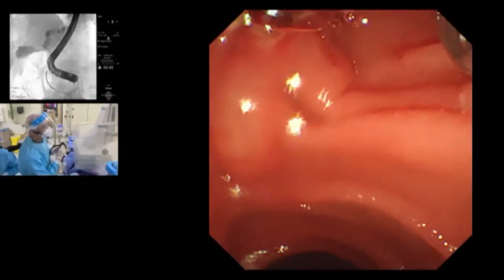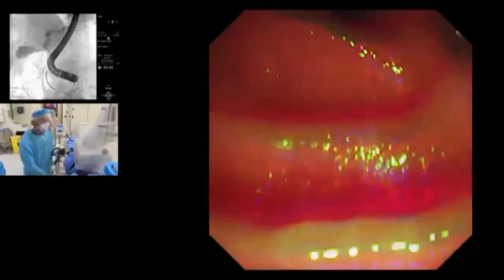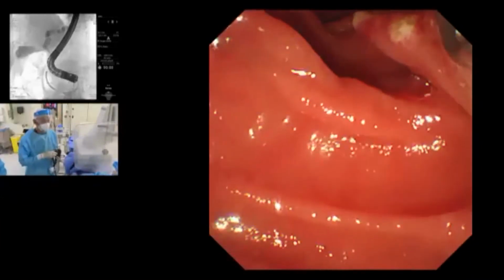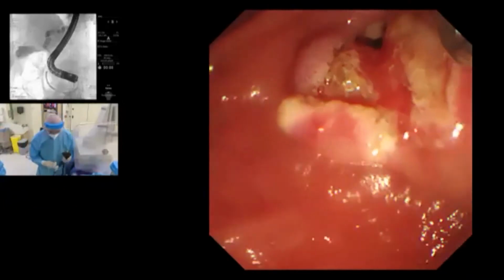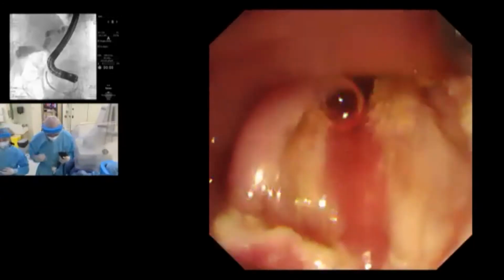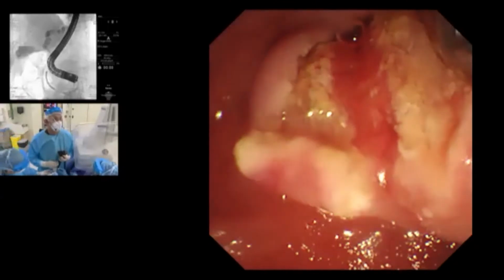Oops. So this patient seems to be easily dropped. It's a bit of an unstable position. Khalid, I totally agree with you. It becomes a burden with a case that is difficult like this. But the advantage of a spyglass is that it's a one-man operation rather than having two people in the room, which becomes crowded sometimes. Let's try to cannulate with the spyglass. Thank you. All right, now I have a good position. I'm going to be a bit lazy and try to see if I can cannulate without the knife, freehand.